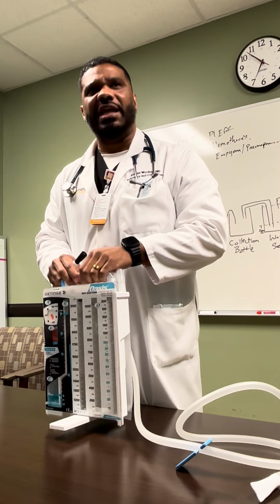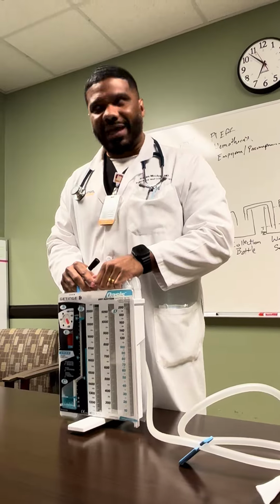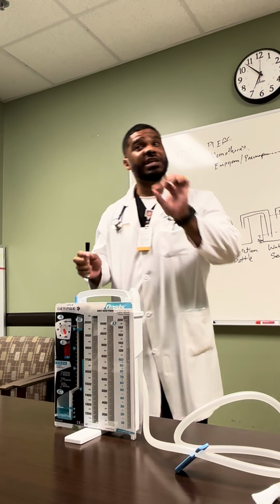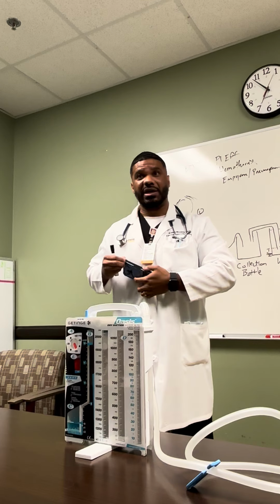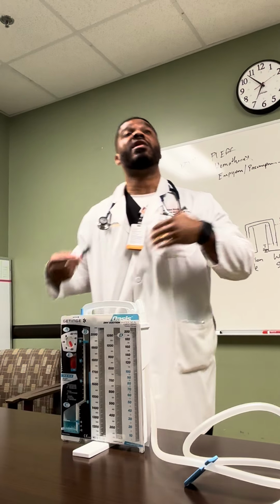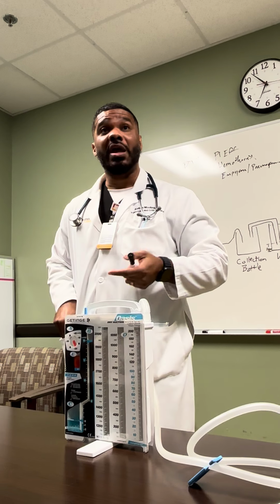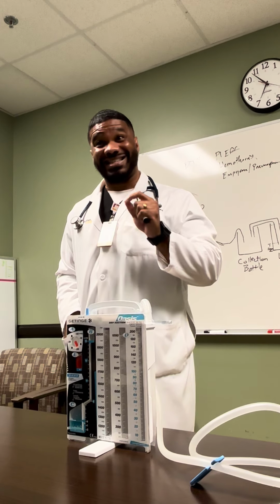But yeah, just remember in general, always look at the patient first, okay? Look at the patient. If the patient's doing okay, you see a little bit of air leak, that's generally okay, all right? We can deal with that. But if the patient is in respiratory distress, you're seeing high intrapleural pressures, raging air leak, that's a problem. Call for the provider.